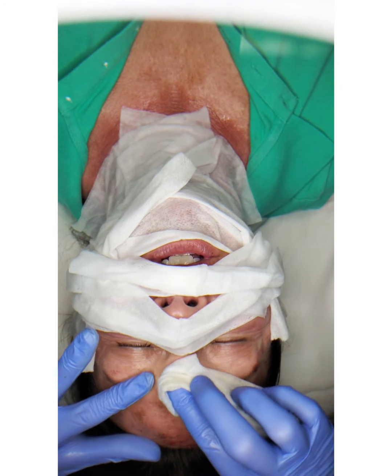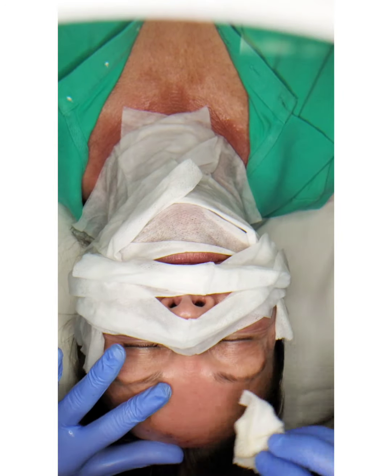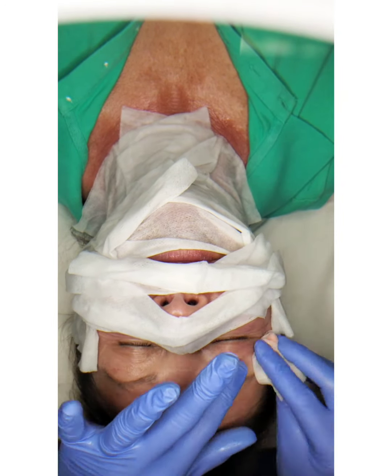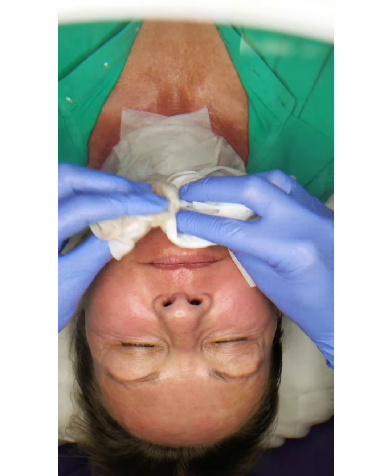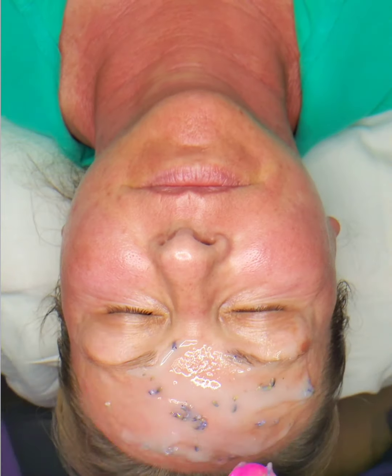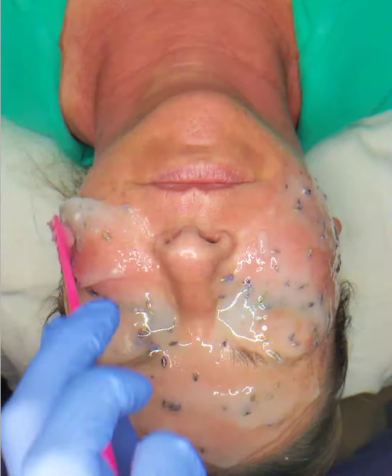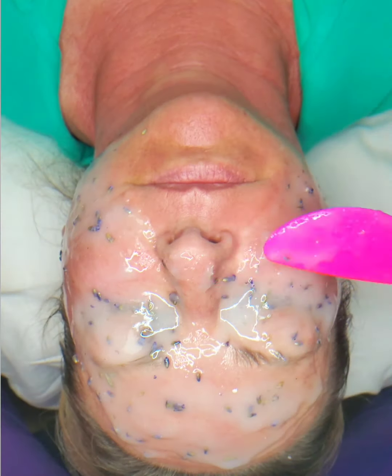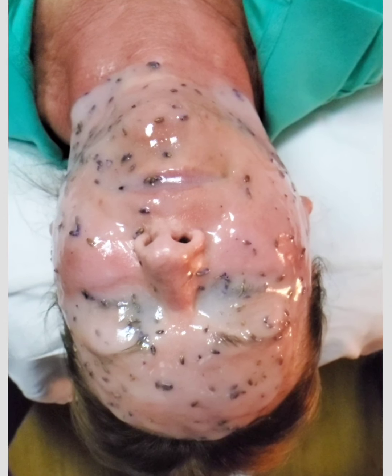That always feels good too. Use some cooling wrap. So I do this to cool down the skin, like she said, but I also do it to clean the blood off of the skin, which sounds gross, I know. And here I'm applying the Intensive Aftercare Hydrojelly Mask. So not only will it reduce that redness, it's also going to be very hydrating, and a lot of patients find it very relaxing.